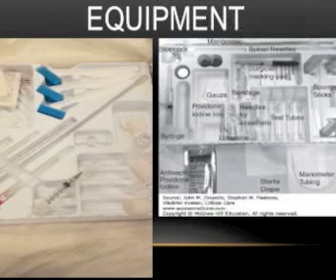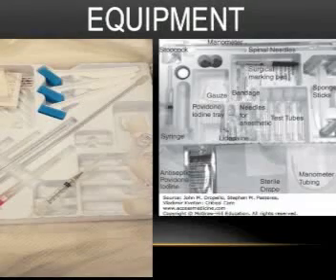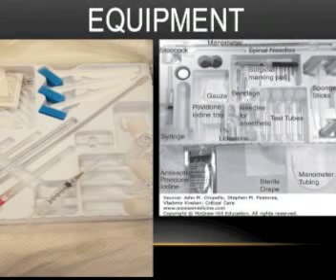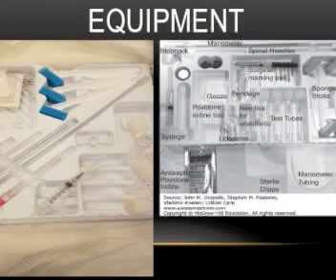Proper PPE is also very important. Sterile gloves, surgical mask, and eyewear should be worn and hair tied back. Depending on the setting, total PPE may be worn including gown. For the purpose of this video demo, gloves and gown will be worn and everything else omitted. Always explain the procedure, benefits, risks, complications, and alternative options to the patient and obtain a signed, informed consent before beginning.